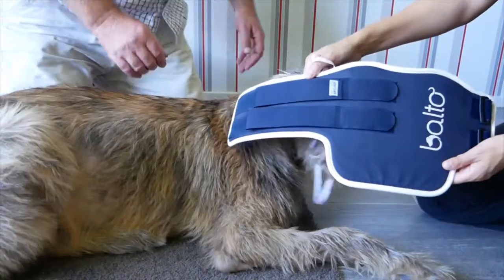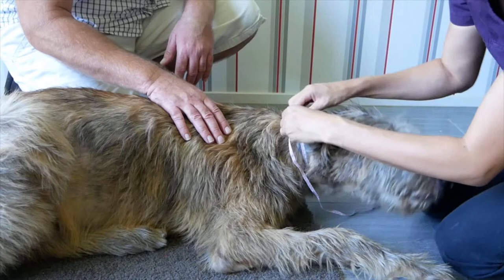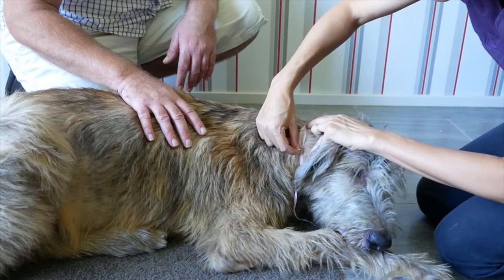The Balto neck brace. To choose the correct size, first measure the circumference of your dog's neck. A snug tape is best, neither too tight or too loose. The same applies when fitting the actual brace.